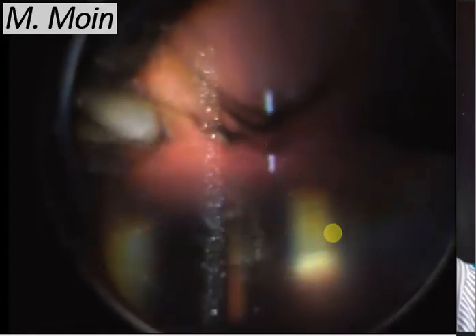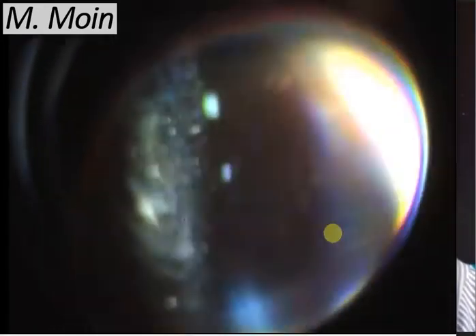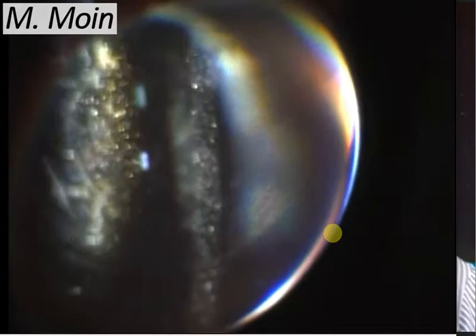I'm moving the eye right and left to try to see the gas bubble better using the superfield lens. Going back and looking at the retina, you can see that sheen on the surface of the retina — the high reflectivity is present, as you see in patients with oil.